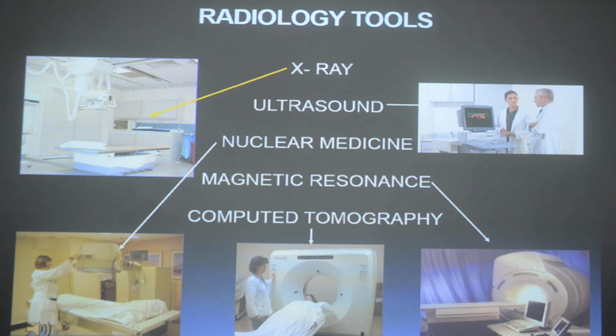Nuclear medicine is still an imaging modality in which you give a tracer through the blood, like you do when you give IV contrast, like iodine and gadolinium. Similarly, you have a radio tracer which is injected, and then you see the metabolic activity in the brain. So in Alzheimer's disease and some other diseases, you would use nuclear medicine. It's a sort of experimental tool in those cases where you are trying to see the degeneration or the metabolic activity in the brain.